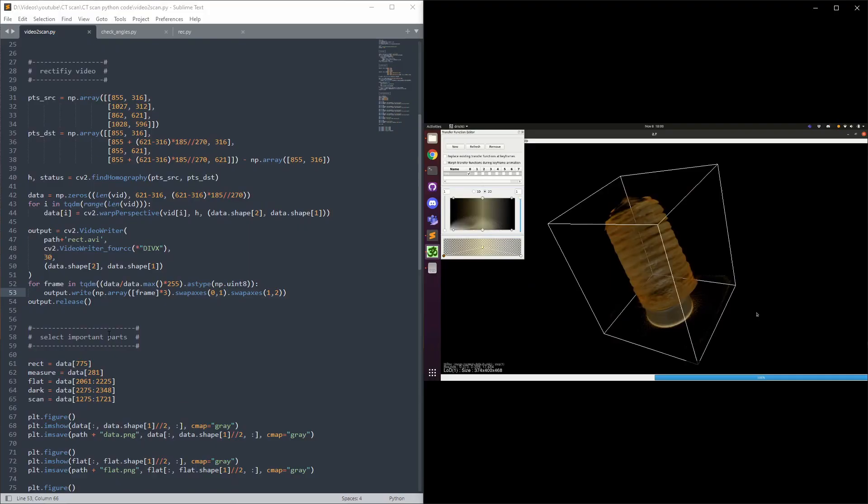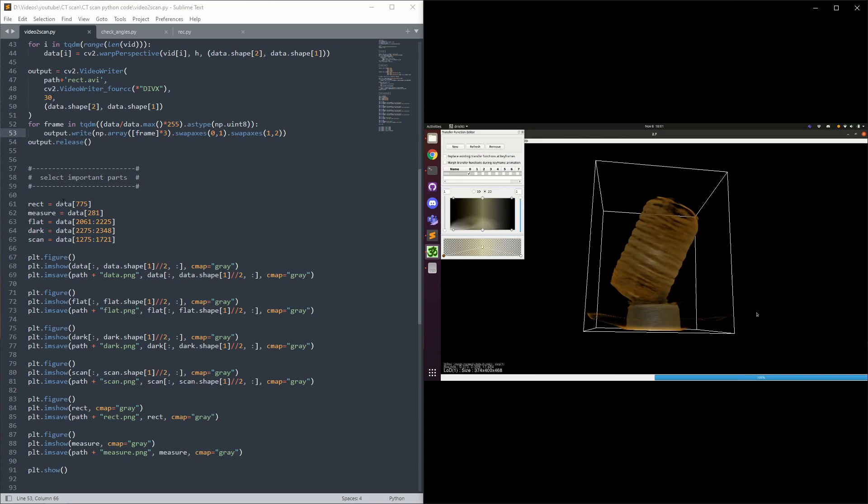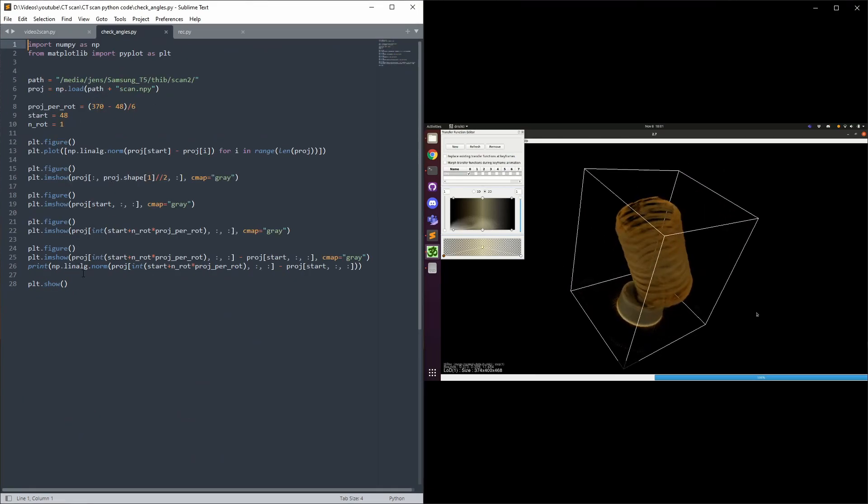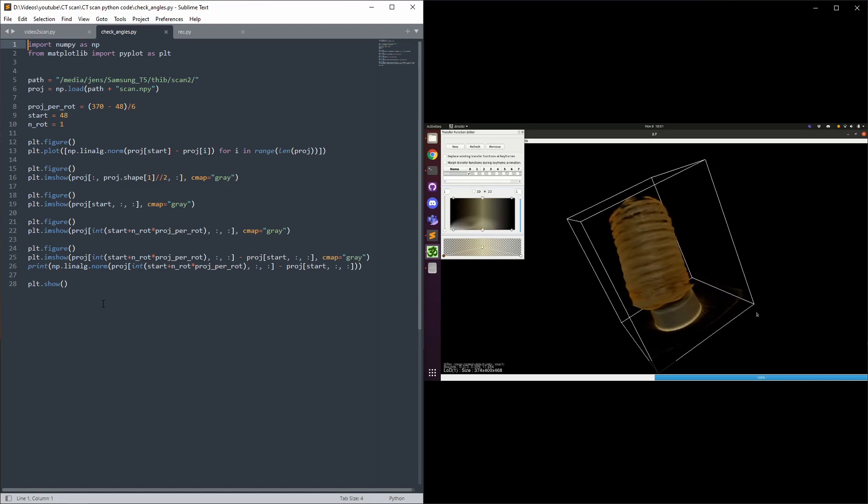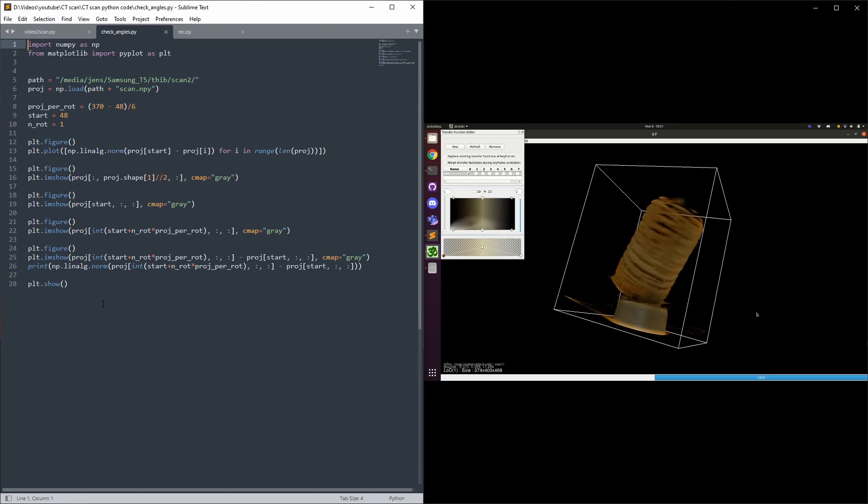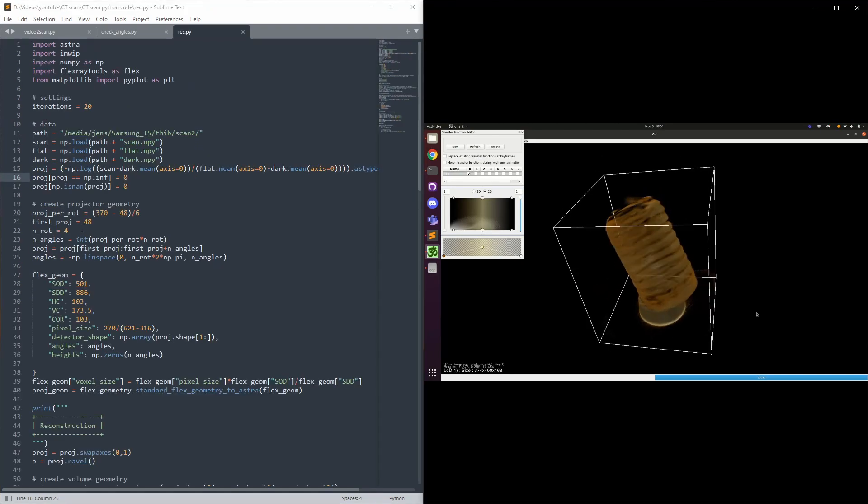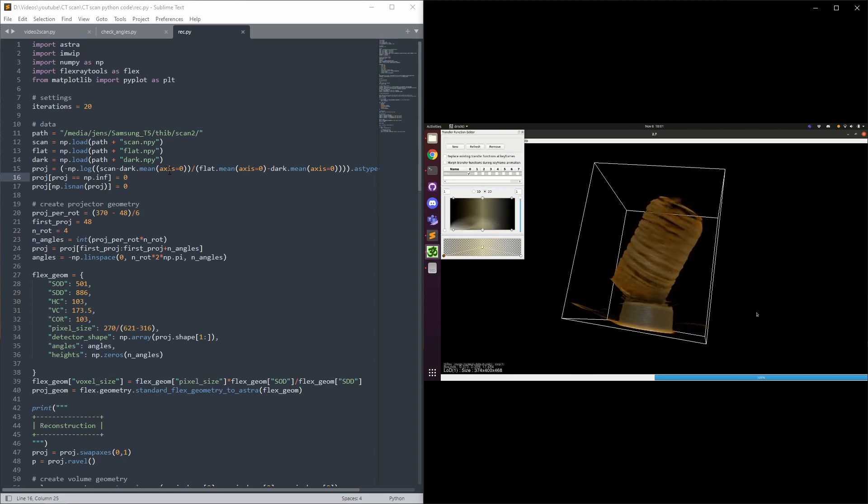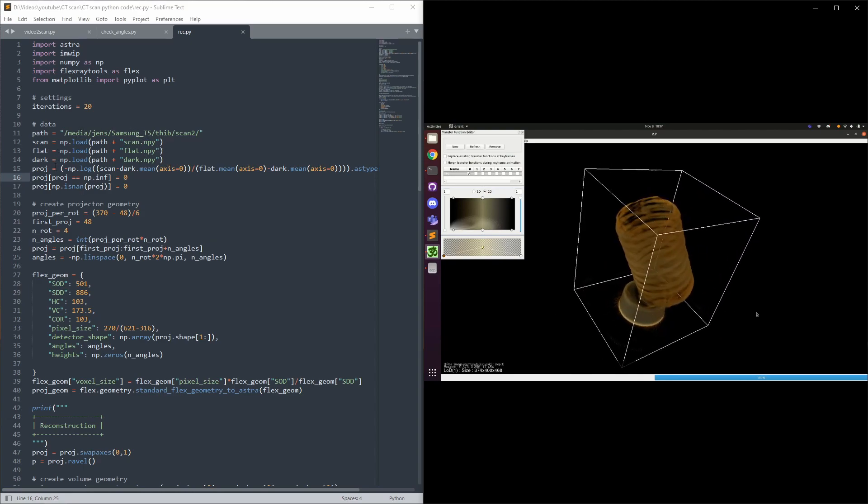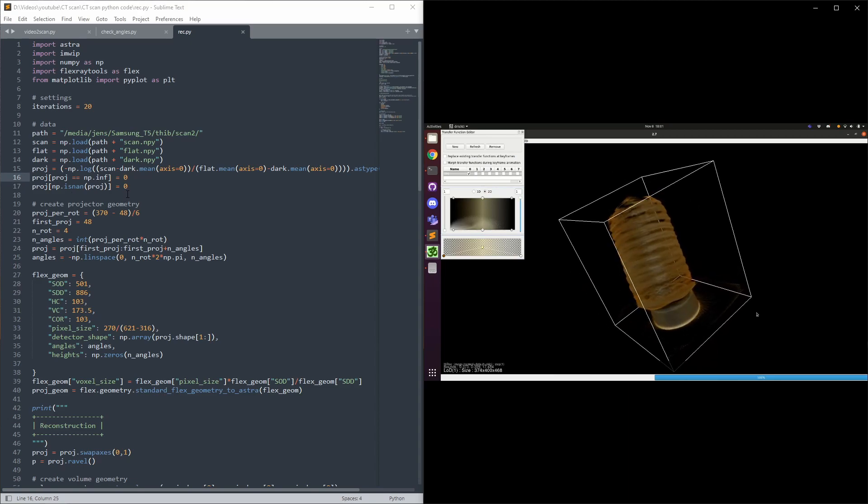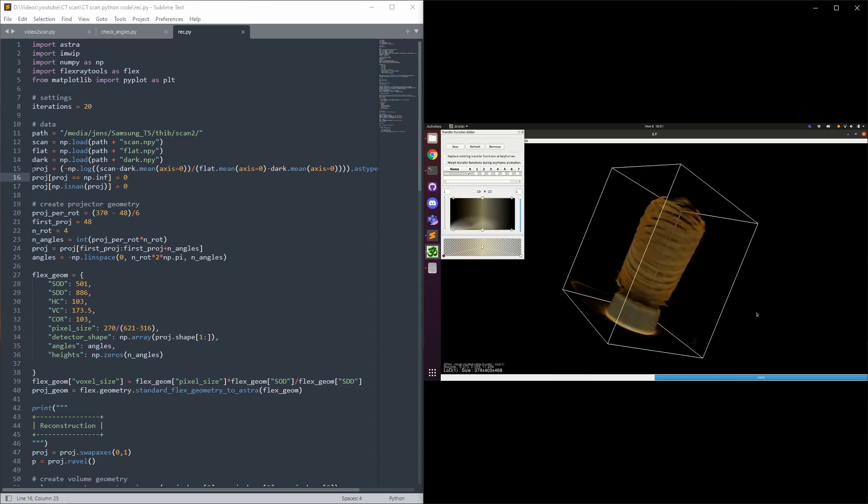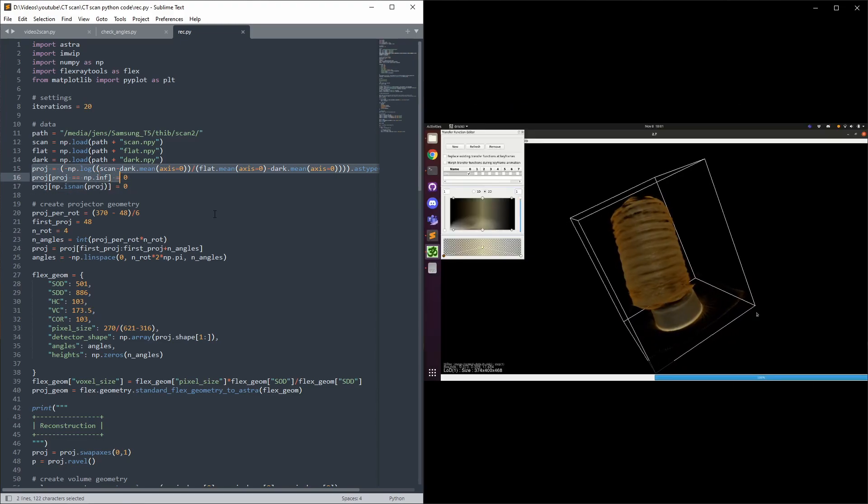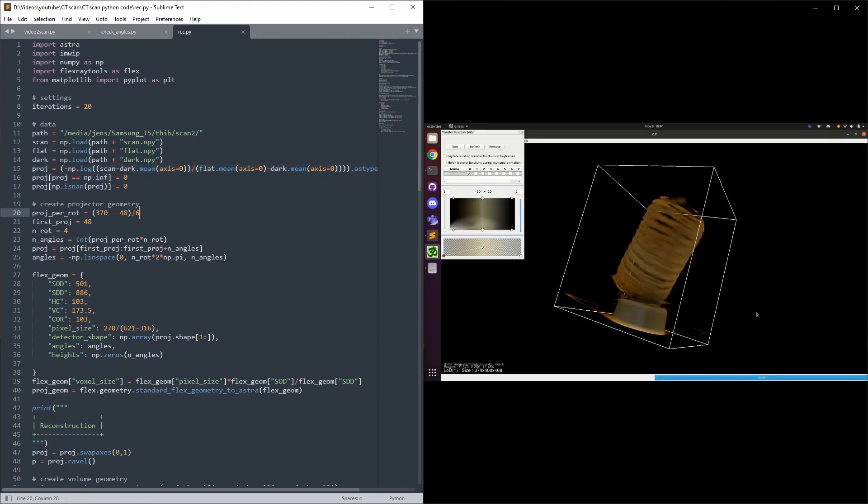And here the relevant parts of the video are selected and saved. This script determines how much the object rotates each frame by measuring how many frames a full rotation takes. And this script is the actual reconstruction of the 3D image. Here we're loading all the data. Remember the dark field imagery measured, this background light is removed here from the scan.